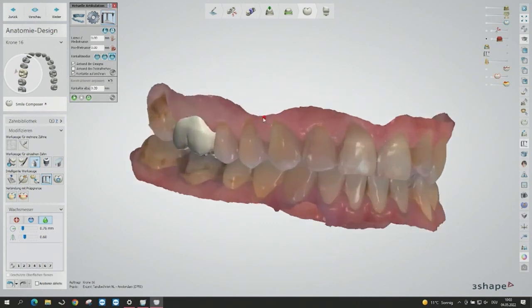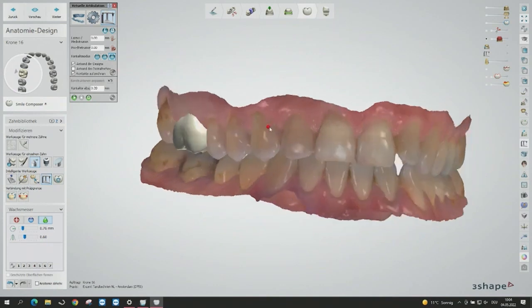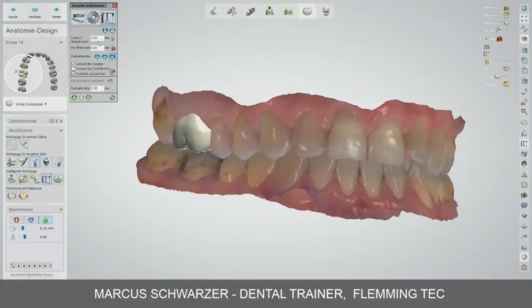Before you use this articulator, you have to switch here from L to U. U means the articulator is moving with the upper, and L is moving the lower, like the SAM articulator. But in the Artex articulator, we move with the upper. Then we can press play.